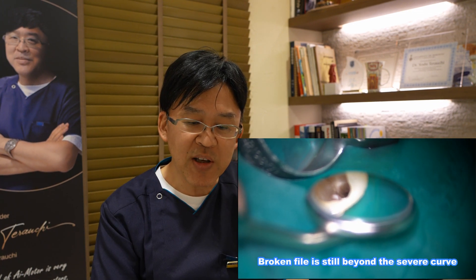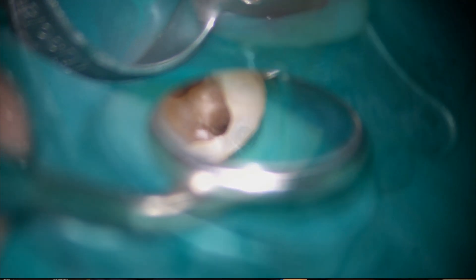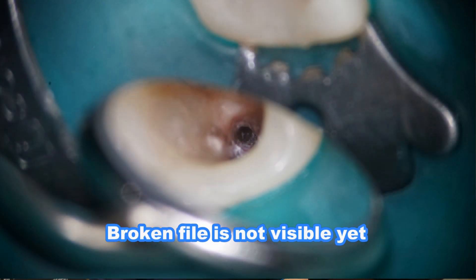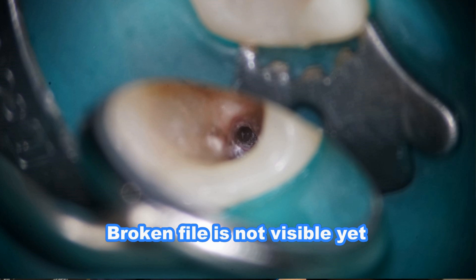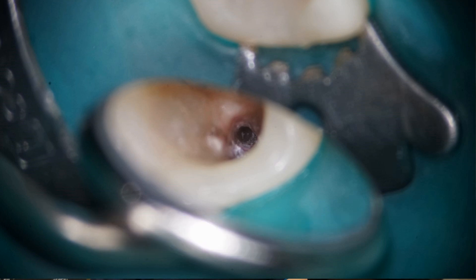At this point, you cannot see the broken instrument, so I waited one week because it seemed impossible to remove it. The broken file was not yet visible, as it had already been more than 45 minutes since I started the removal procedure.